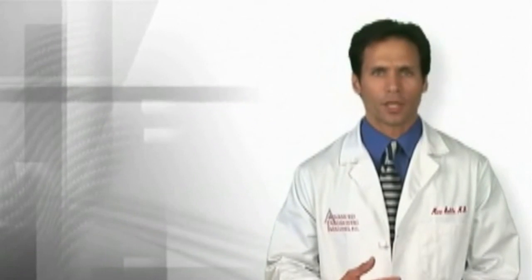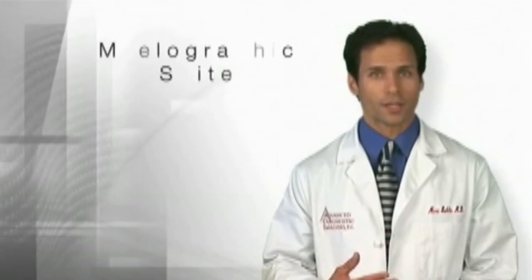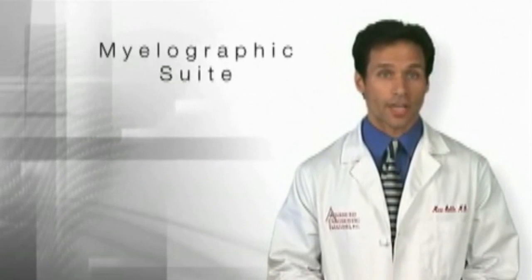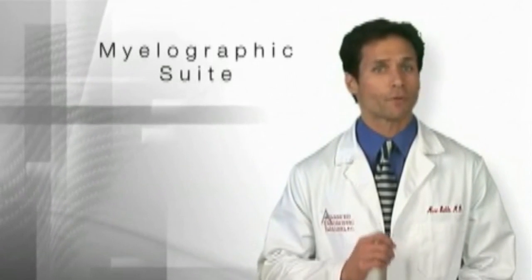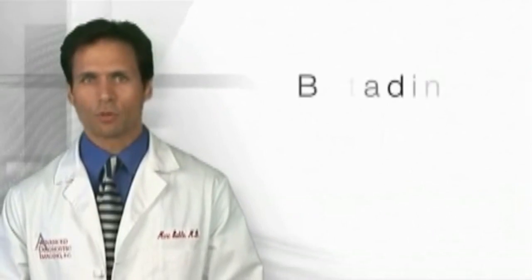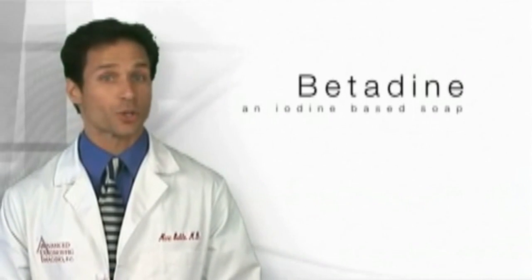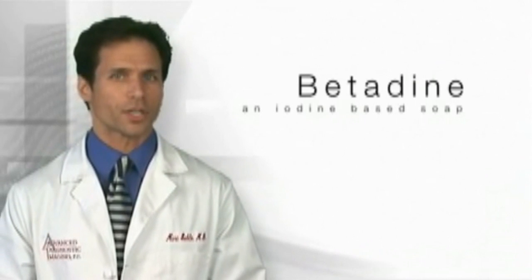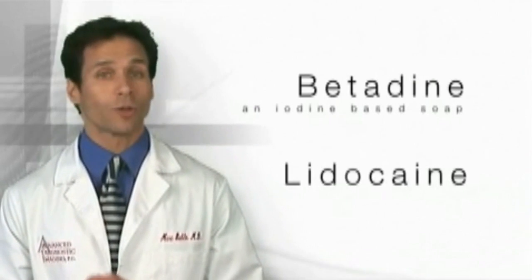Prior to the myelogram, you will change into a gown. You will then be taken into the myelographic suite. After you lay down on the examination table, the physician will use an X-ray camera to determine the best location for the spinal injection. Your skin will be cleaned with betadine, an orange iodine-based soap which will feel cold against your skin. A sterile drape will be placed and you will be given some numbing medicine called lidocaine.